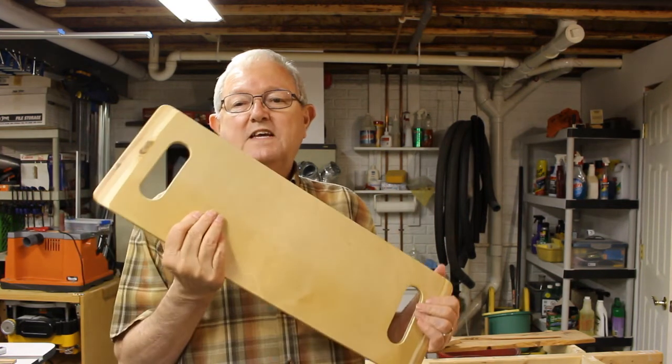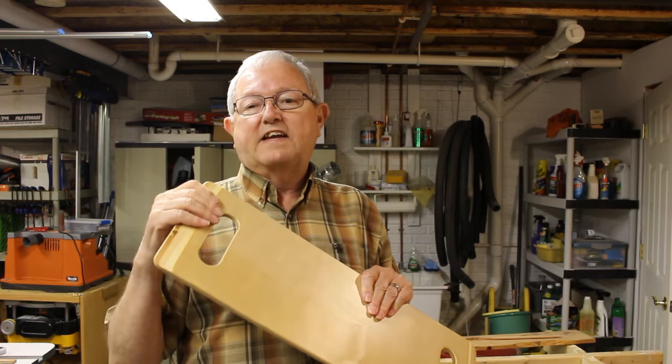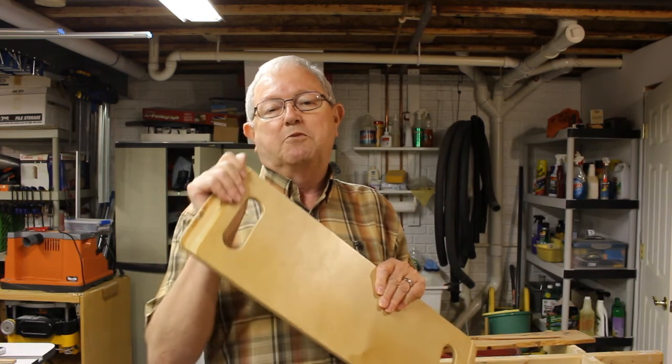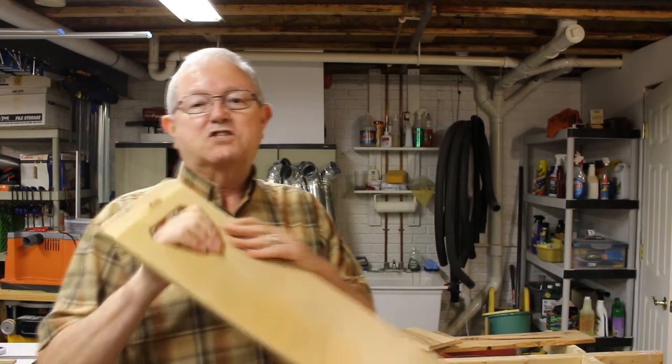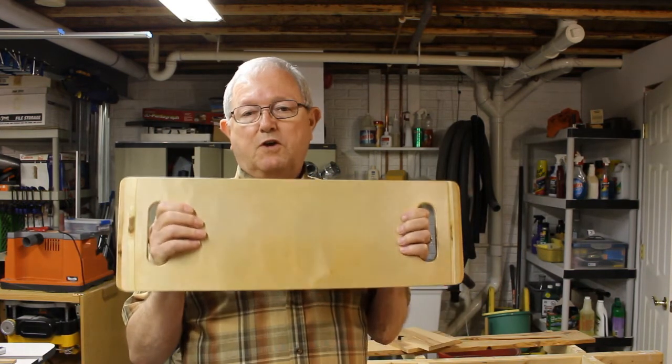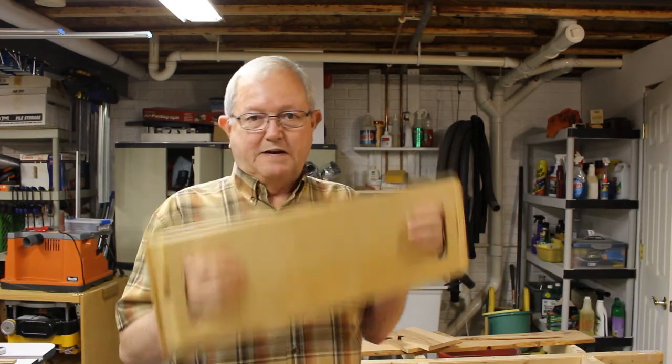I'm all set now to put some finish on this. This project's done. I ended up putting some shellac on it, sanding that down a little bit, and then putting a light coat of lacquer on it. That seems to match the finish on the rest of it pretty well. All I have to do now is deliver this to my daughter.